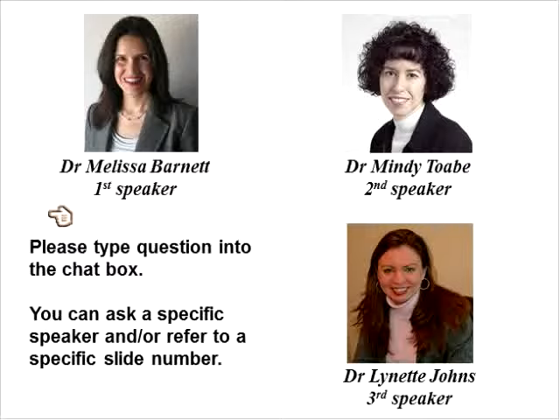In our practice, I find that it is sometimes useful if you have a patient with very dry eyes to use a preservative-free artificial tear, and you can put it directly into the scleral lens upon insertion, or the patient can use a non-preservative solution such as Unisol and put that right into the scleral lens prior to insertion.